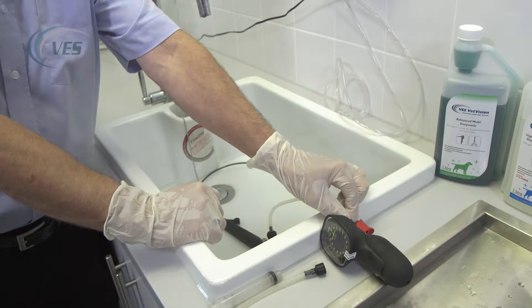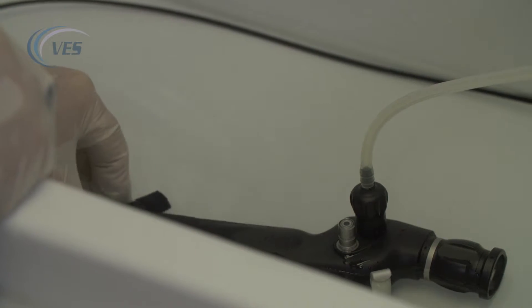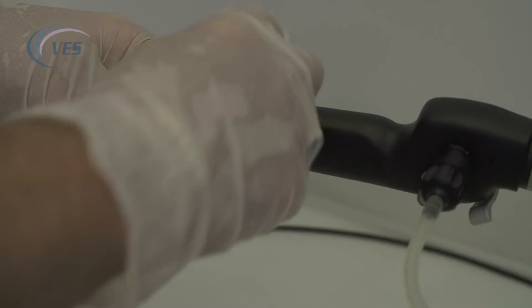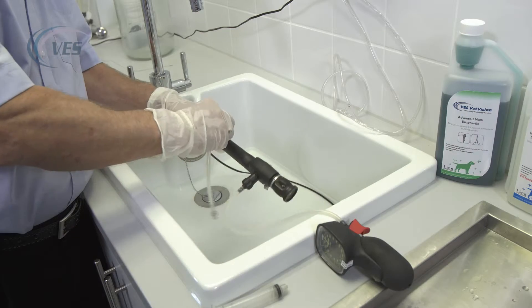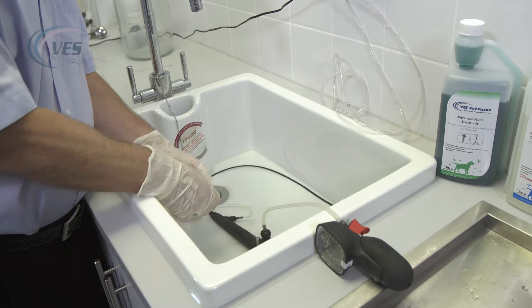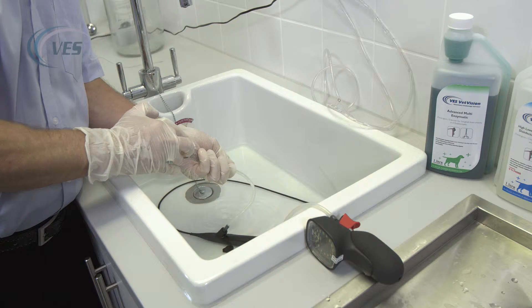What we have to do is flush the scope through with Enzymatic. By removing the biopsy port here and attaching our flushing adapter, we get a small syringe, draw up the Enzymatic, and flush through the scope.